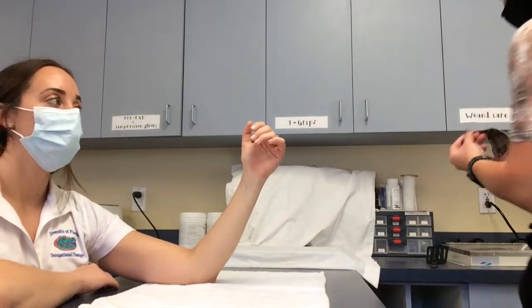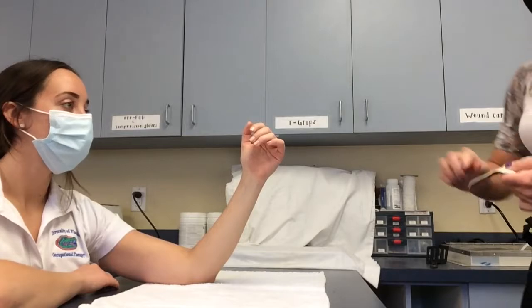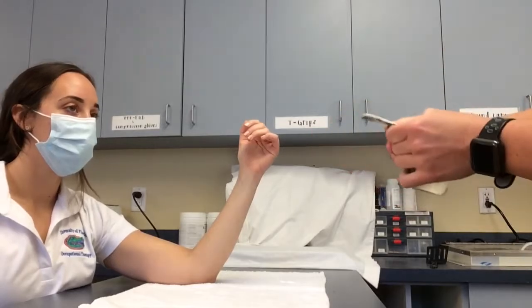Next, you want to use the hot water and round the edges of the orthosis, ensuring that there are no pointy edges. Also, place back onto the patient to ensure that it fits properly.